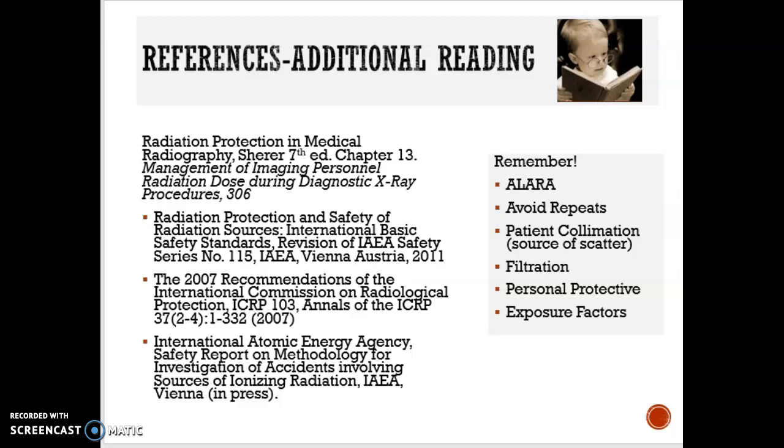You've learned so many things, and some of them you may have already known. But what I want you to take home today is always to remember ALARA. Keep those doses as low as is reasonably achievable, because it also reduces scatter and dose to yourself. Try to avoid repeating. If the X-ray image is not perfect but shows you what you need to see, don't repeat the image.